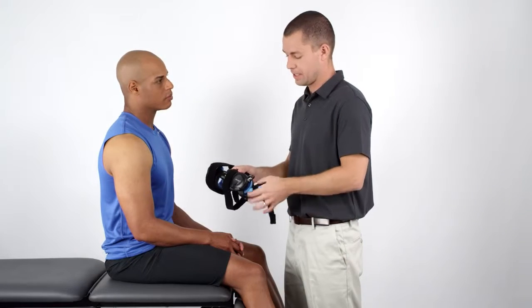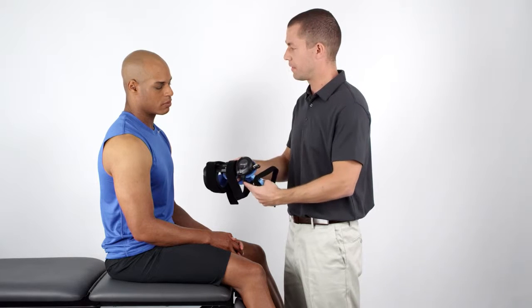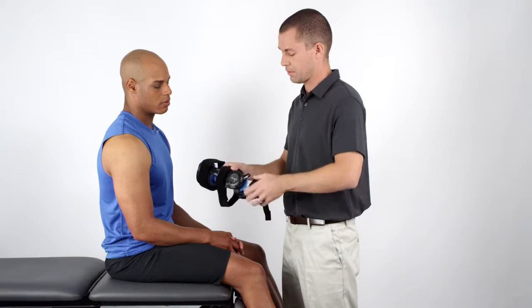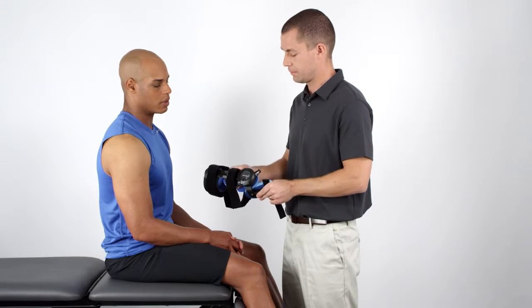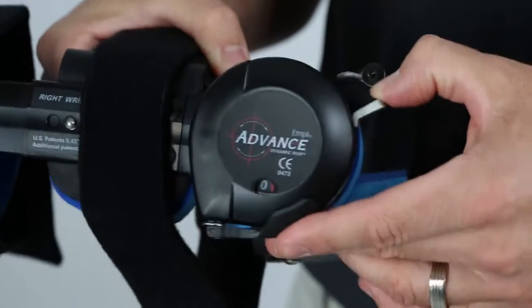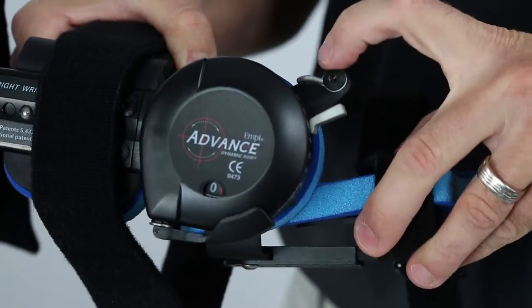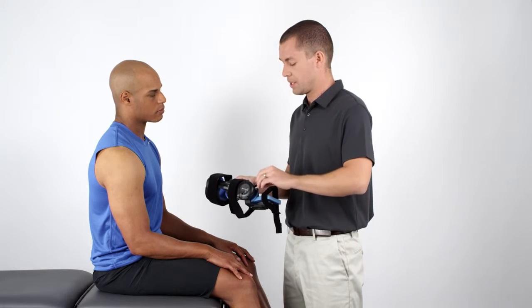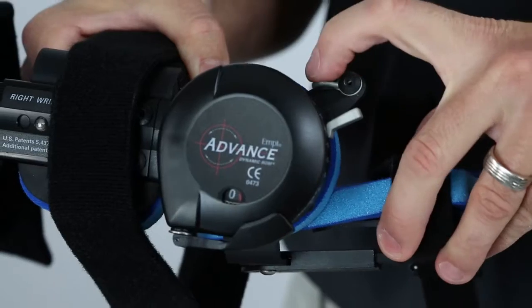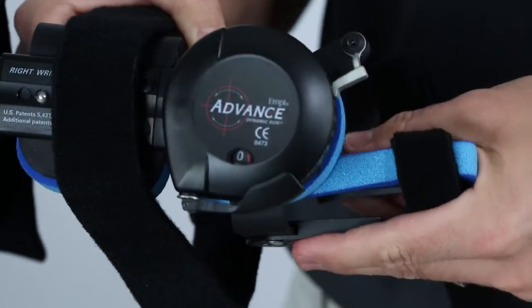The locking mechanism on the orthosis is designed for easy application and removal of the device and can be engaged in 5-degree increments throughout the patient's range of motion. To secure the lock, simply depress the lock lever while placing a slight amount of force on the strut until the lever rotates and locks down into the desired angle. Then rotate the lock lever's safety until it engages beneath the lock lever.